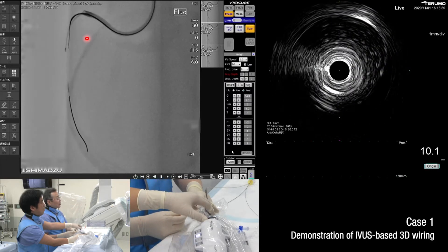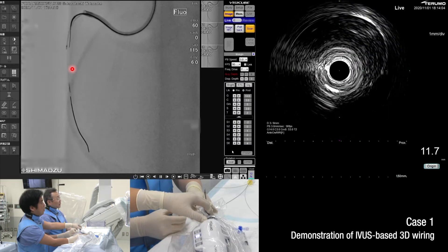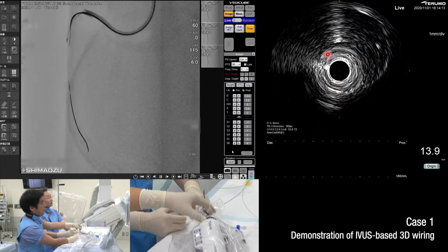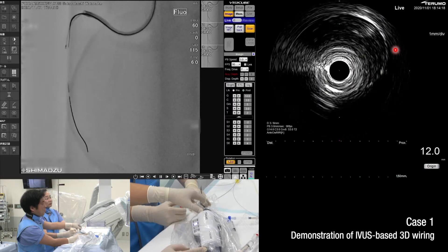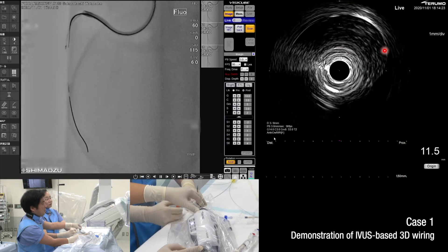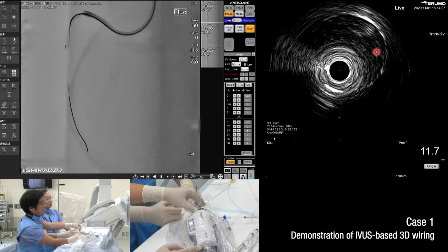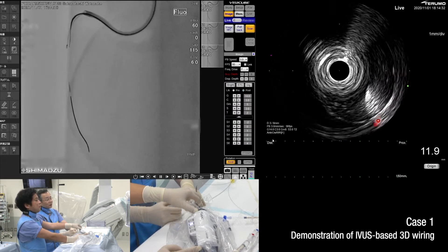On the fluoroscopy image, the guide wire tip is directed to the right. We will rotate it clockwise for the tip to be facing toward us. Just now, the tip is facing toward us — this is the guide wire tip using the tip detection method. The tip is now directed to 1 o'clock.